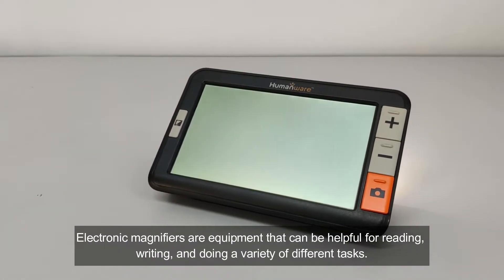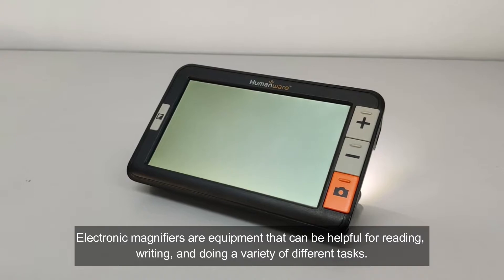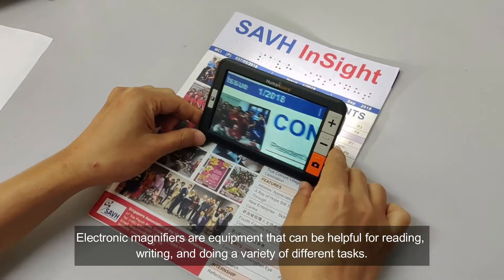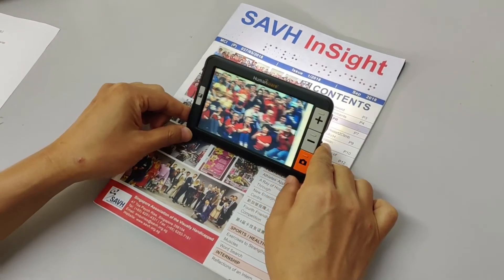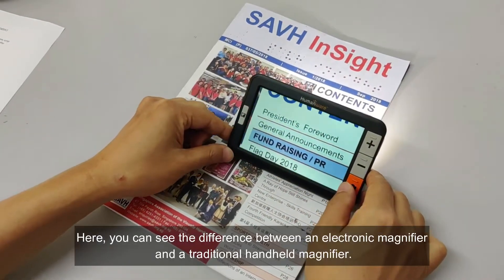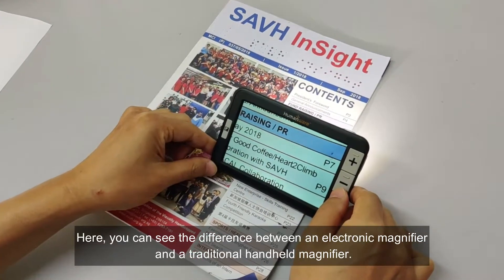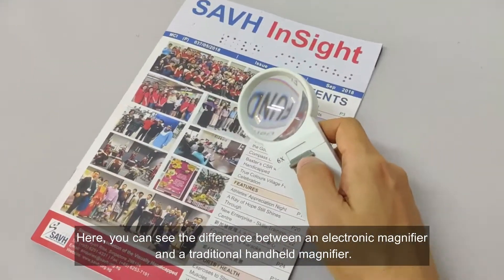Electronic magnifiers are equipment that can be helpful for reading, writing and doing a variety of different tasks. Here, you can see the difference between an electronic magnifier and a traditional handheld magnifier.